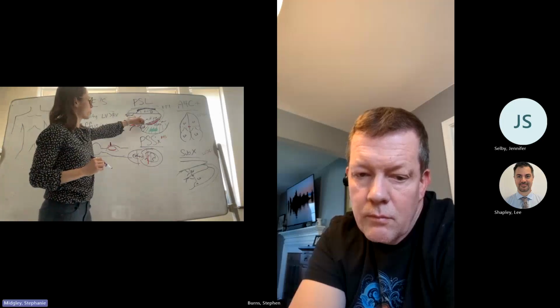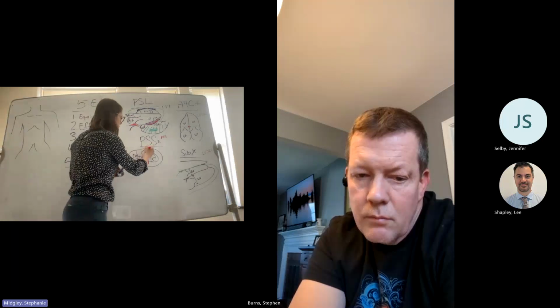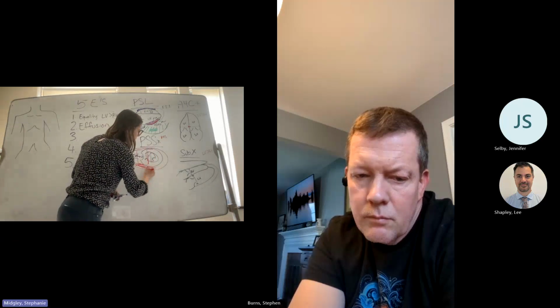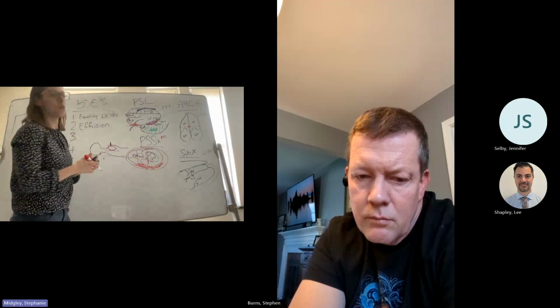All right, so that's your parasternal long, right? So we're looking dependently. In our parasternal short, same thing, right? We're looking dependent. So I'm looking down here. Parasternal short is actually my favorite view for effusion because it's much simpler.